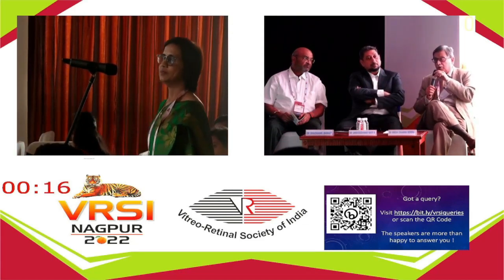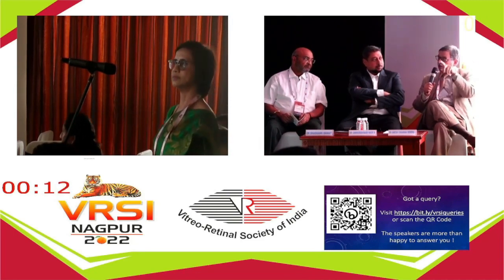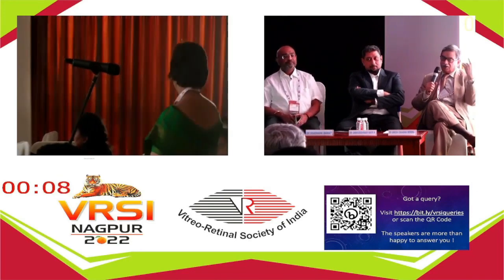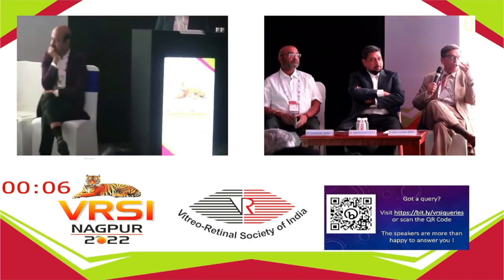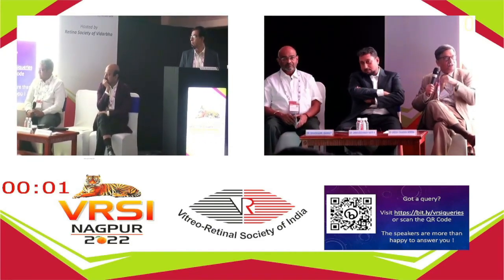Maybe a hybrid where the surgeon works with the microscope but the assistants get the same thing on the screen in 3D would be the best, which takes care of the teaching, takes care of the work, keeps the surgeon happy, if the surgeon is happier with the 3D. Thank you.